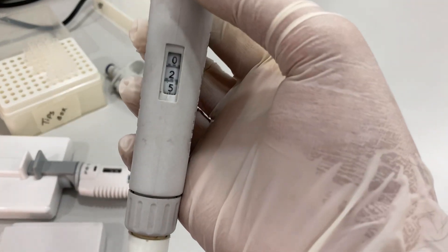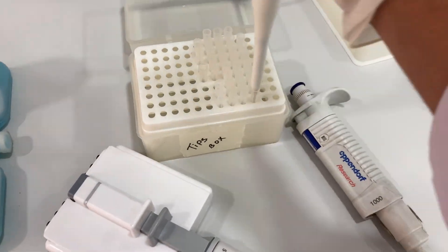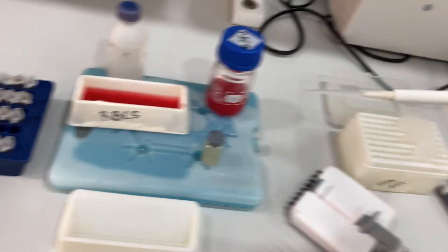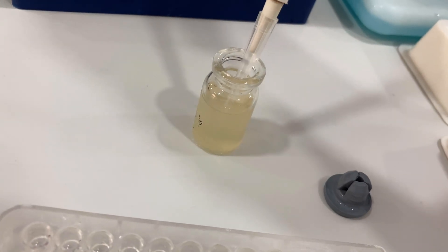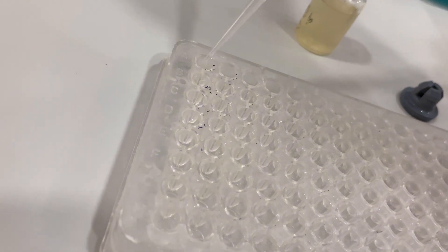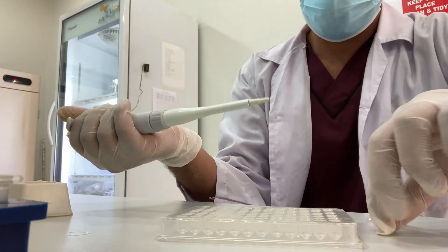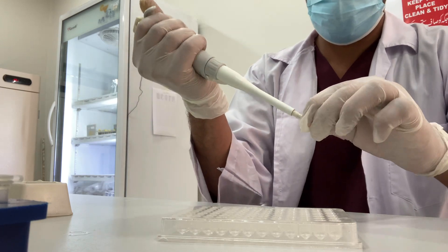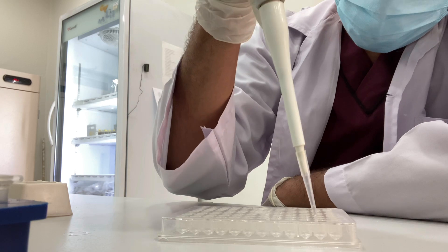The second step in the HA is to add 0.25ml of virus in the first well, and then we will do the serial dilution. Now we are performing the serial dilution from well one to well 11. Don't forget to discard the 0.25ml from the last well.